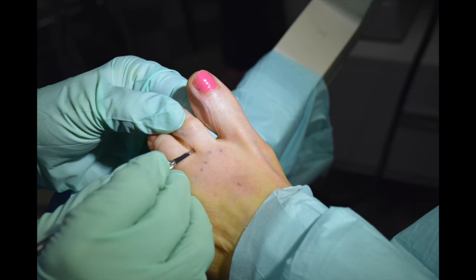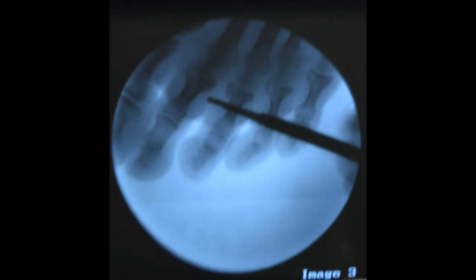First, we started with a lateral incision on the second toe. This is done down to the periosteum and freed up utilizing a small rasp. This will be the path of the burr in which we make the osteotomy on the proximal phalanx.